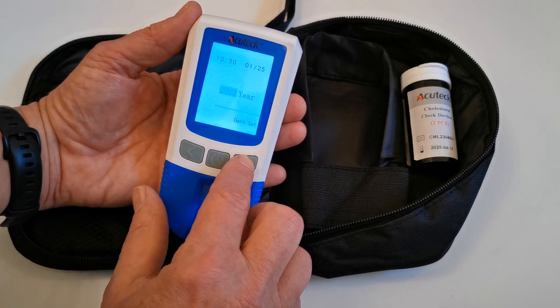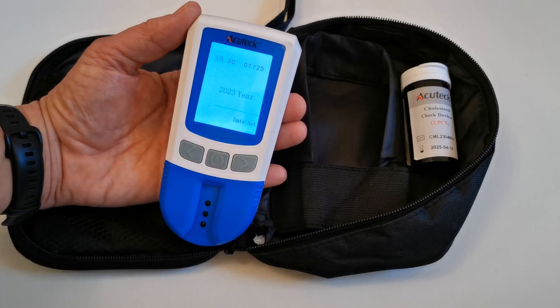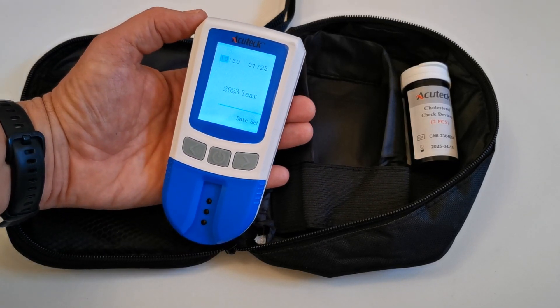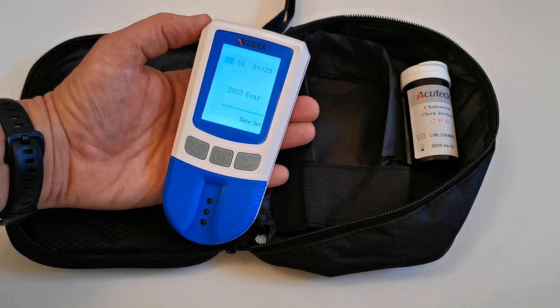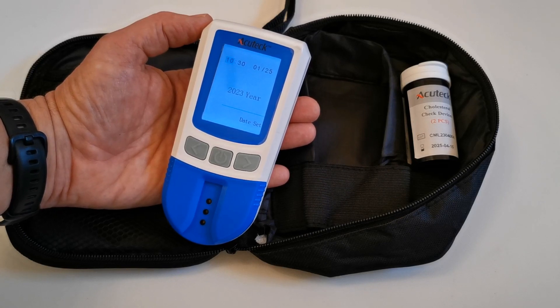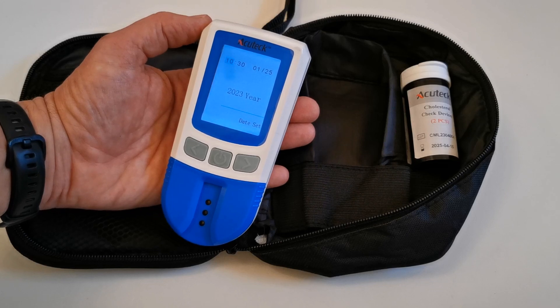When you're happy with the date, select the year and navigate that up to 23. When you're happy, you can just press the power button again. Obviously, that's asking to go through the menu a further time. If you now just leave this meter to power down, it will retain the date, time, and calendar settings that you've put into it.